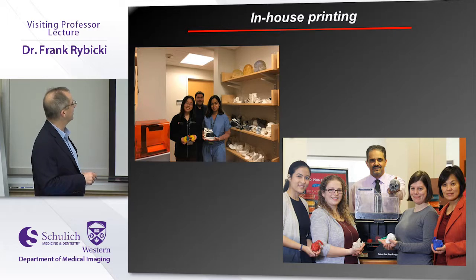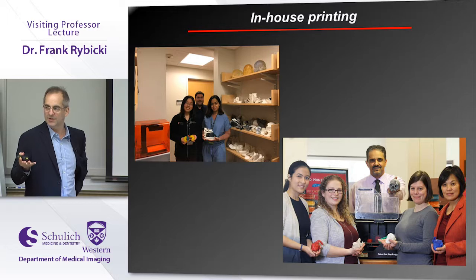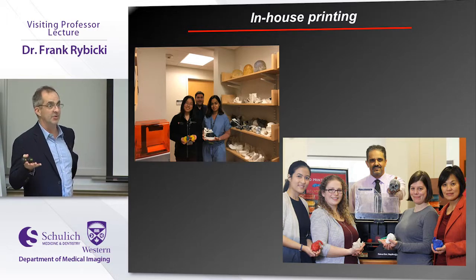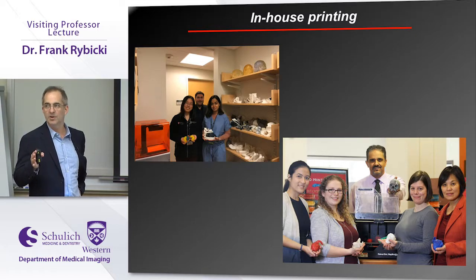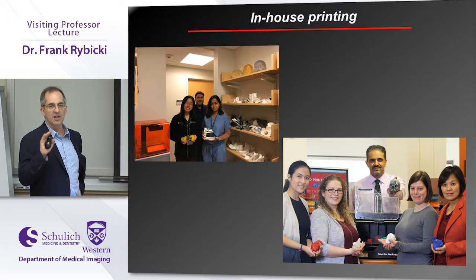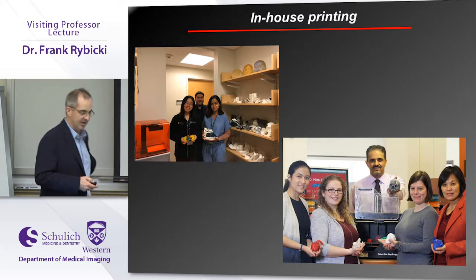These are some of the face transplant models, but every one of these was a case that went to the OR where the interventionist or the surgeon used the model and said, I can't do it, you can't do the case without it. Like, no one will touch a Pancoast tumor. No surgeon will touch a Pancoast tumor the day after you give them the first model. No hepatic surgeon will touch a cross segment liver resection the day after you give them the model. They say, I have to have that model or I'm not doing the case, right? And next thing you know, you'll have a huge library of models.